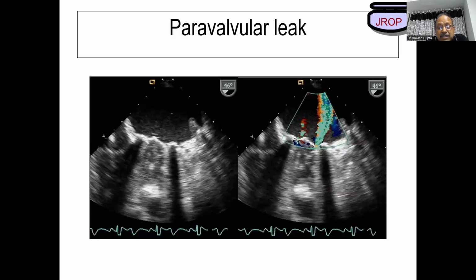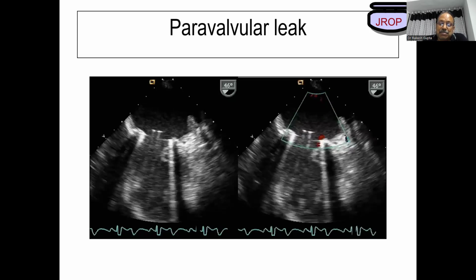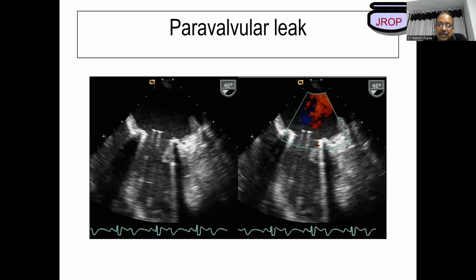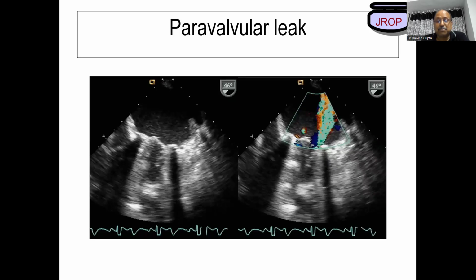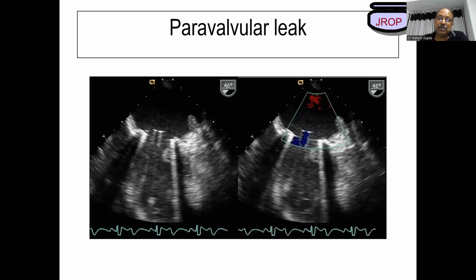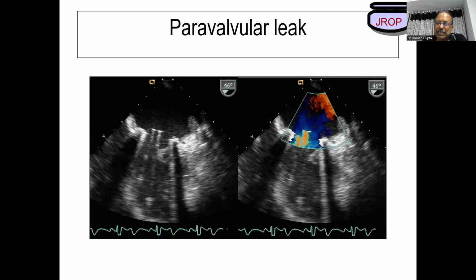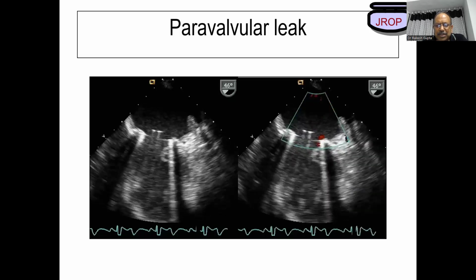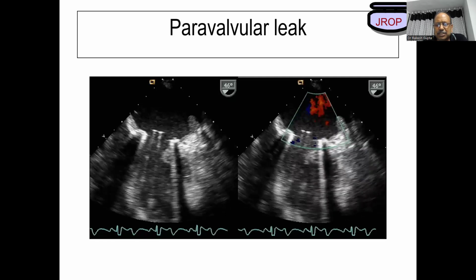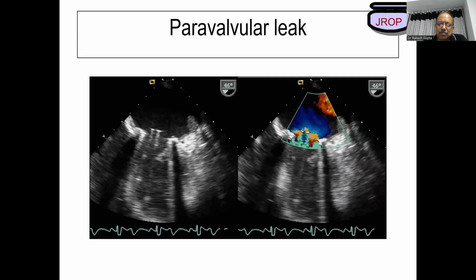So remember certain things which will make you stand apart from other people as a star in that area. So this is important to learn. That's why it's important to learn echocardiography. You can make a hell of a lot of difference in clinical management. Patient presenting with breathlessness in the midnight. How can you differentiate whether breathlessness has come from a cardiac or respiratory cause? Just put a probe and you'll find it out quickly. The rest you can put your mind together.